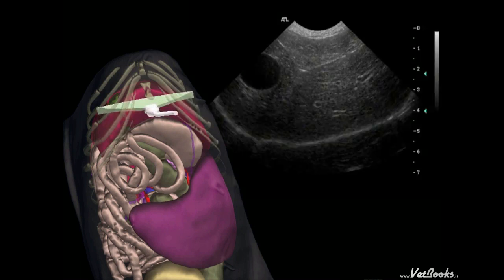A convex probe with a small footprint is most appropriate for a complete evaluation of the liver. When placing the probe slightly caudal to the xiphoid process, in a transverse plane to the patient and oriented cranially, the anechoic gallbladder is identified. The gallbladder is located to the right of the midline, but on the left of the image, since the probe marker is placed to the right.